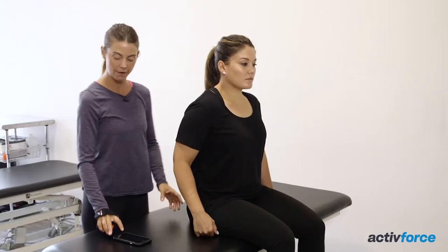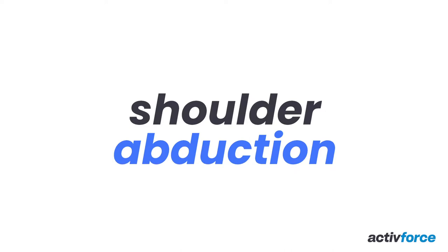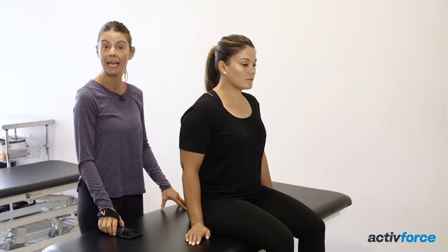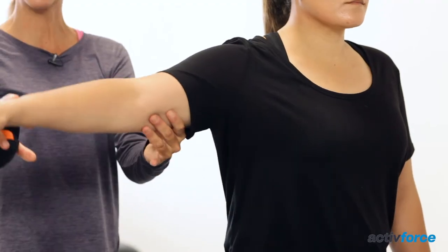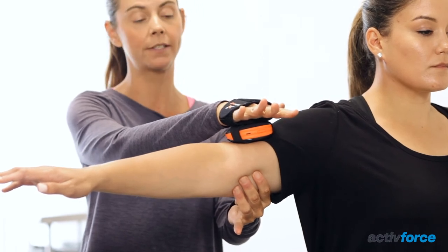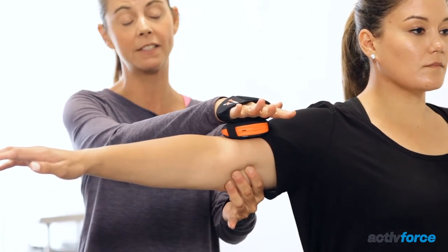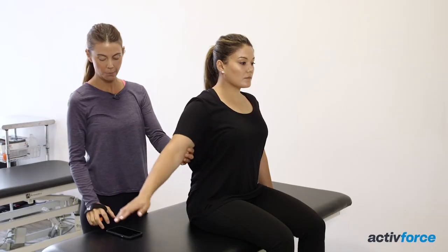Press save in the Active Force app. To test shoulder abduction, press start in the Active Force app, have them abduct to 90 degrees, place the Active Five on the distal end of the humerus and have them squeeze up into the Active Five for five seconds, and rest. Press save in the Active Force app.